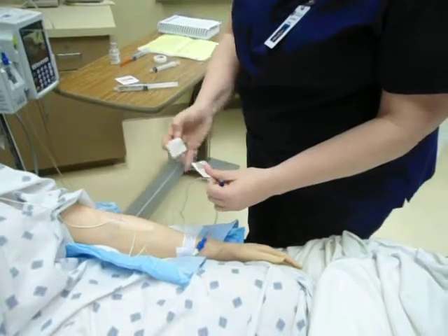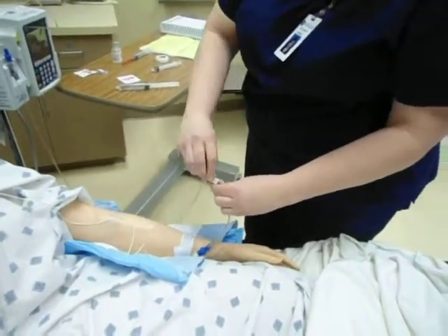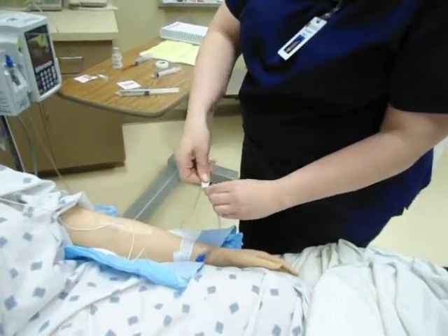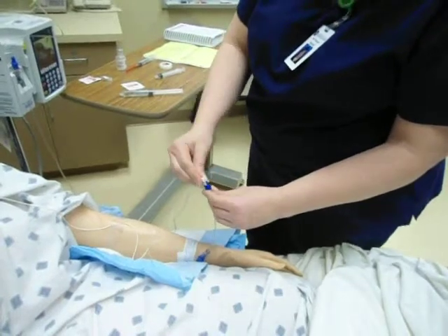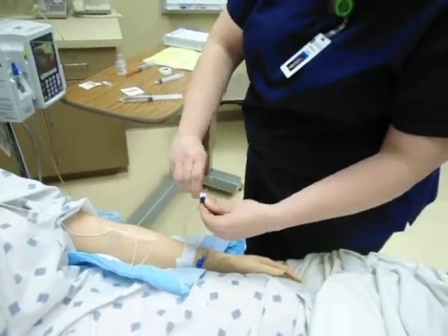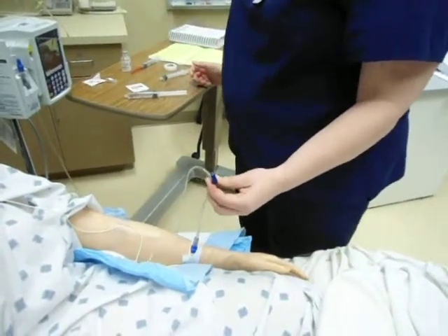I've explained this procedure to the patient so they know what I'm doing. I'm going to go ahead and scrub the hub for 15 seconds at least, not only the sides but also the top. Okay, so now I've got that done.